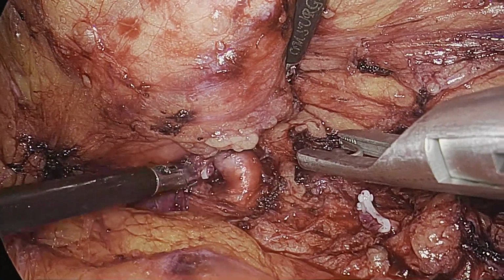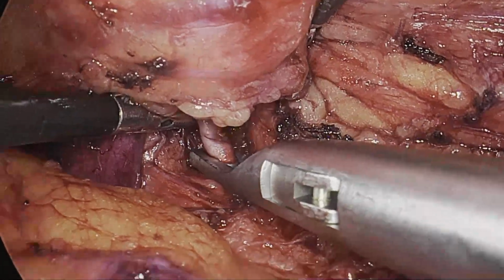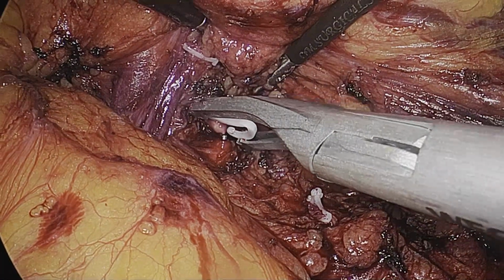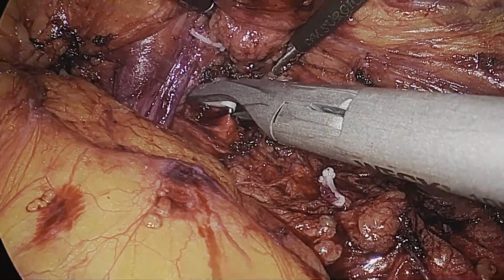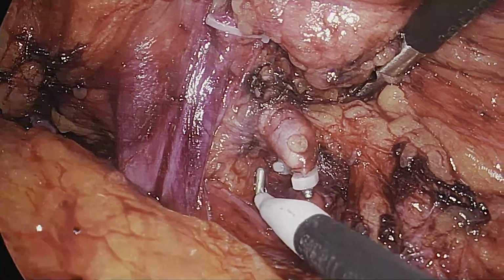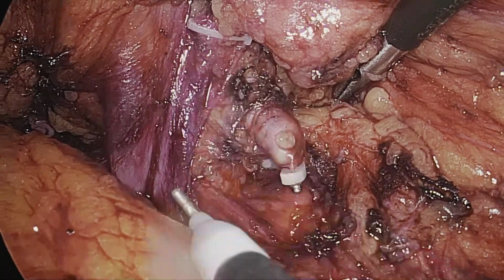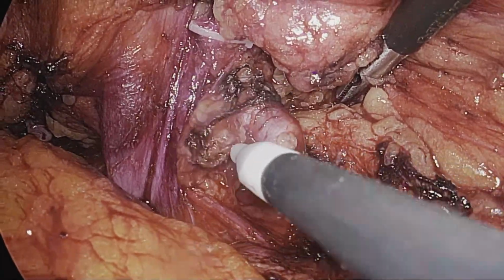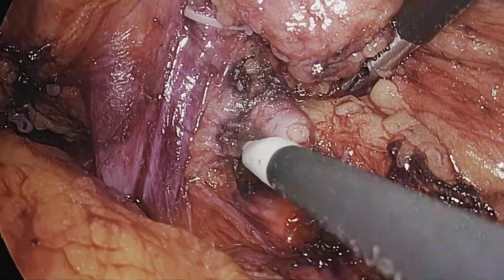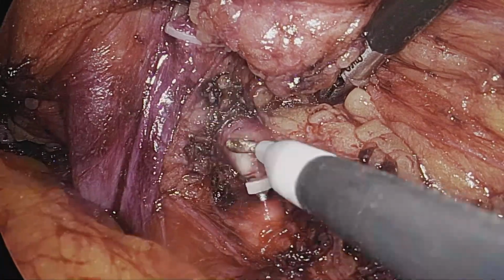So here we are applying a metallic clip just to reduce the flow in the kidney and the tumor. While applying the metallic clip, we could feel the resistance of this atherosclerotic plaque that could possibly be within the artery, and that made us apply the clip with some difficulty. But Hem-o-lok clips definitely are more secure and have a proper seal lock over the artery stump.